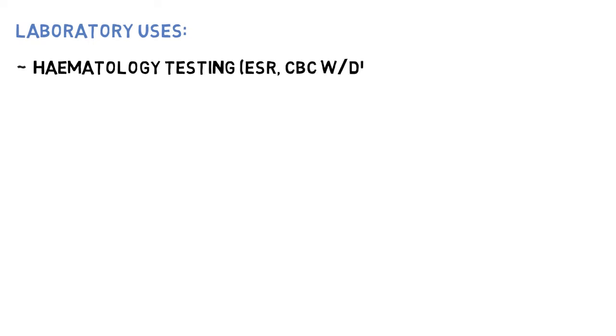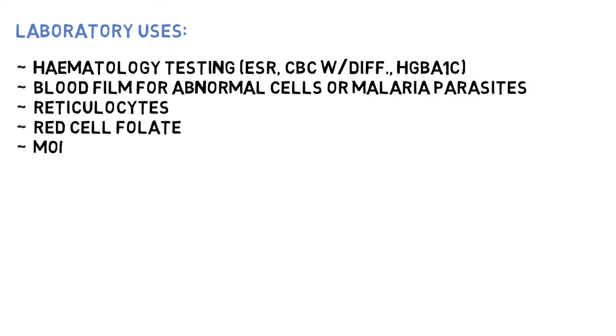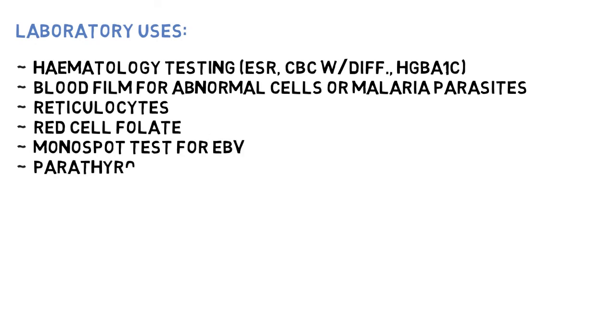Lab uses. It is used for hematology testing, ESR, CBC, differential count, HbA1c, blood film for abnormal cells or malaria parasites, reticulocytes, red cell folate, monospot testing for EBV, Epstein-Barr virus infection, parathyroid hormone blood level.